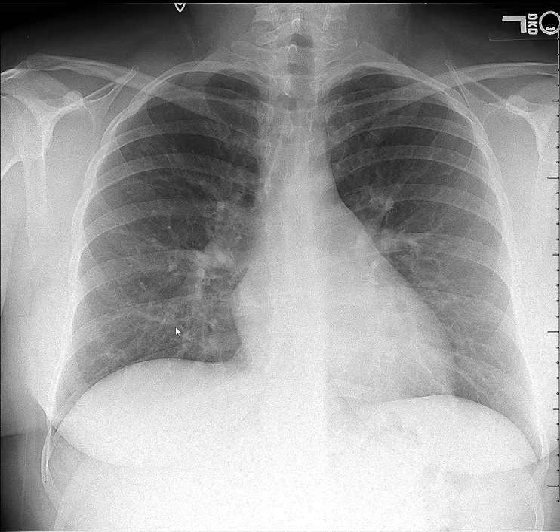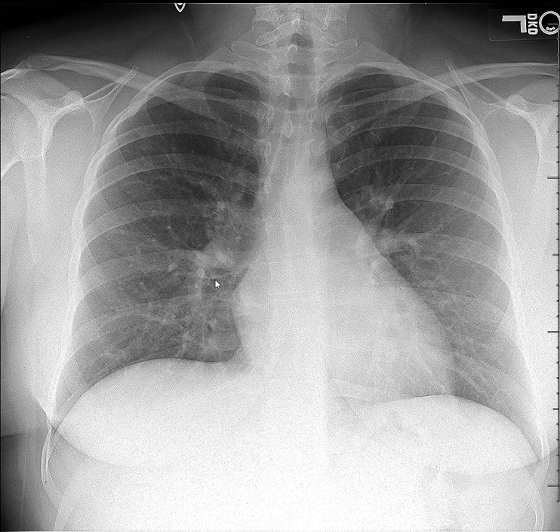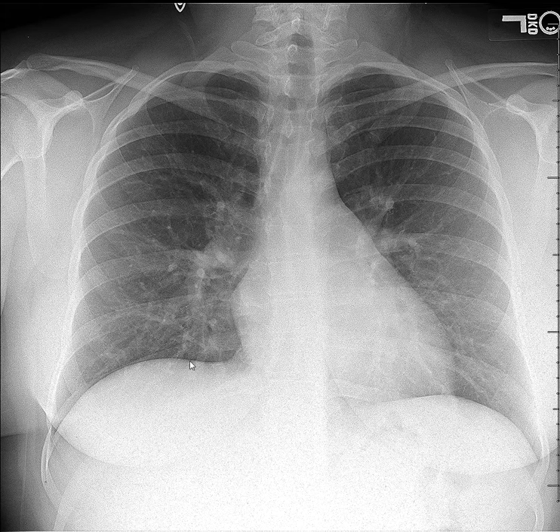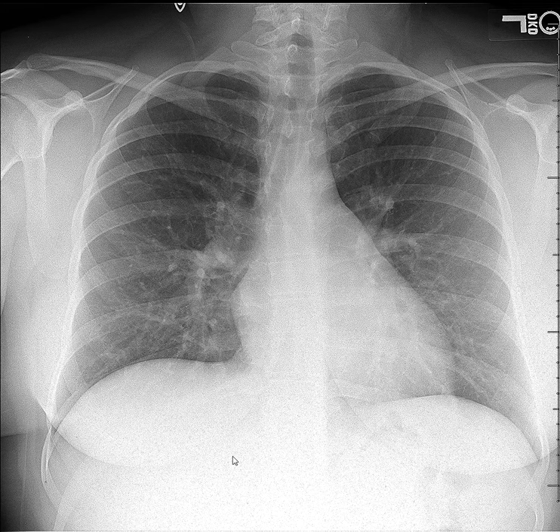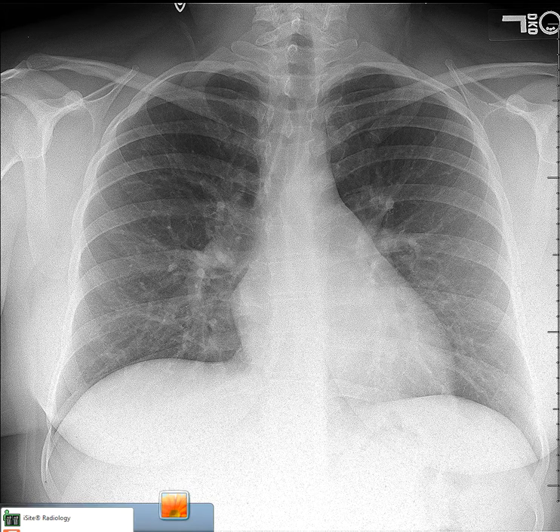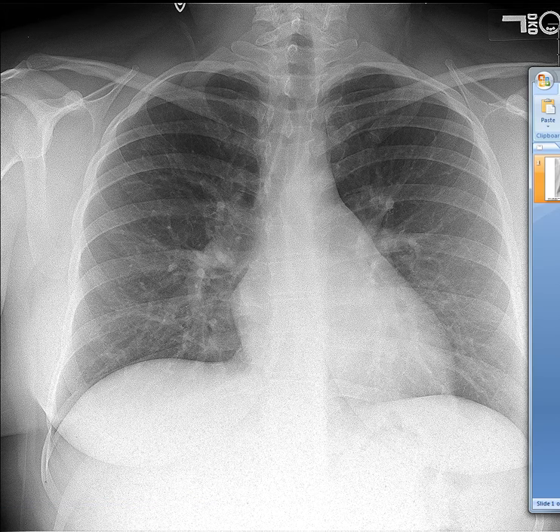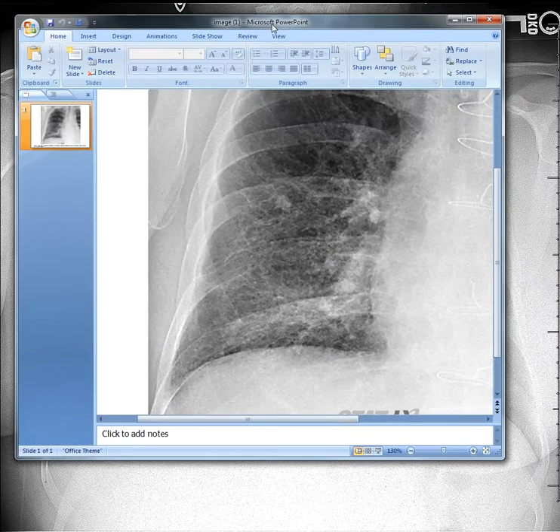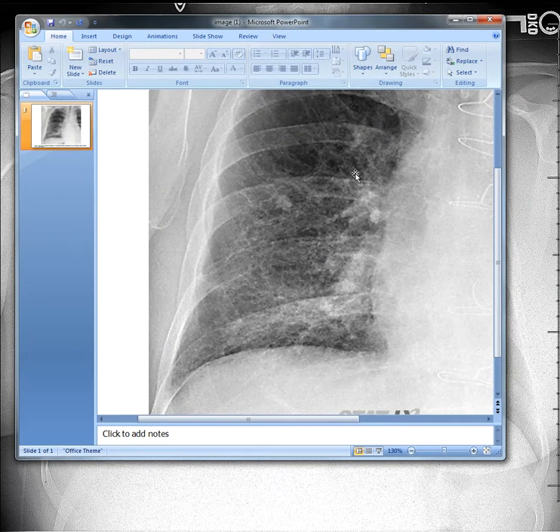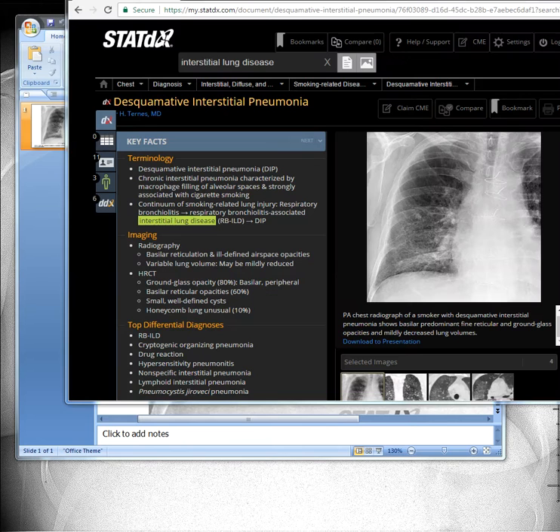The reason we want an expanded view is so we can see any subtle abnormality. This is especially important in interstitial lung disease. For example, this case is a DIP — desquamative interstitial pneumonia.